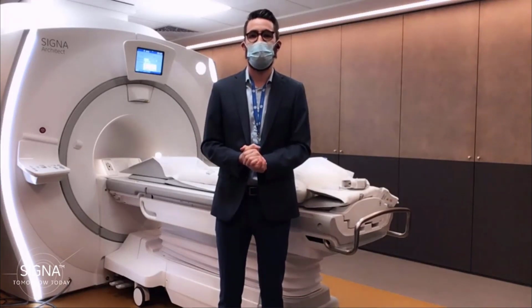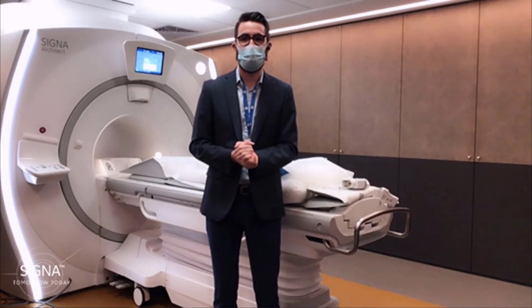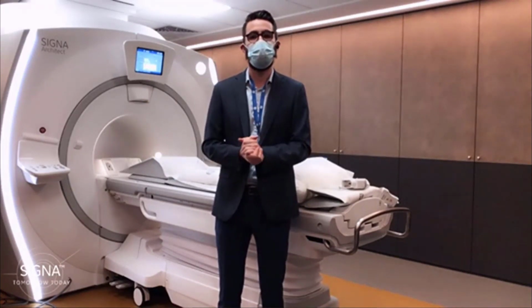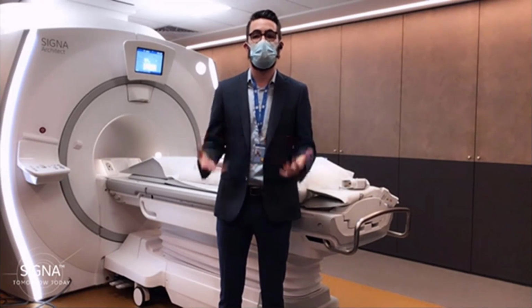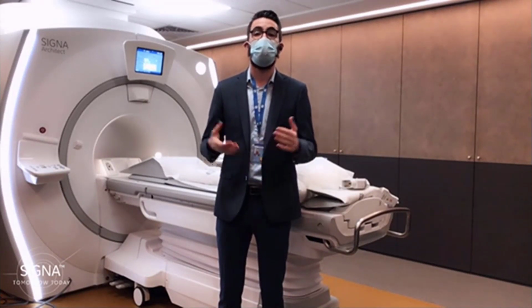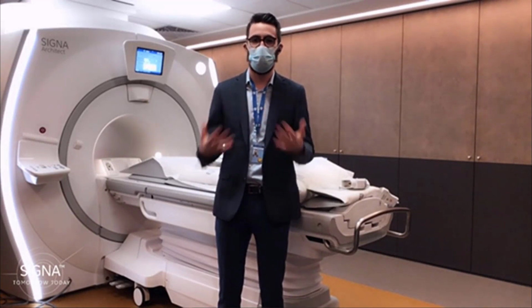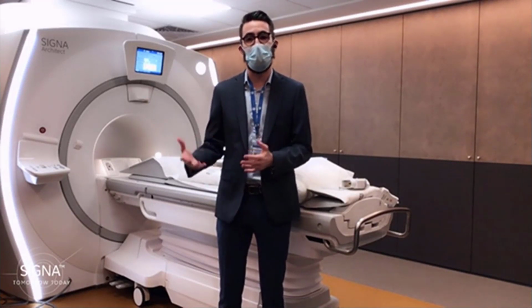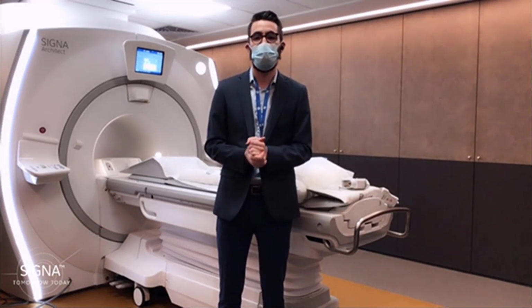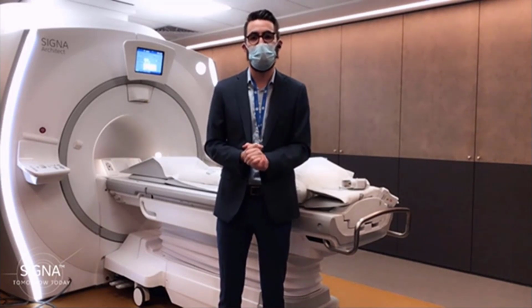I think now we are at the point where we are starting today's subject. Today we are going to see improving reproducibility and clinical consistency using Signaworks AIQ edition for body imaging. The Signaworks AIQ edition is our latest platform, the last software version we put on the market several weeks ago.